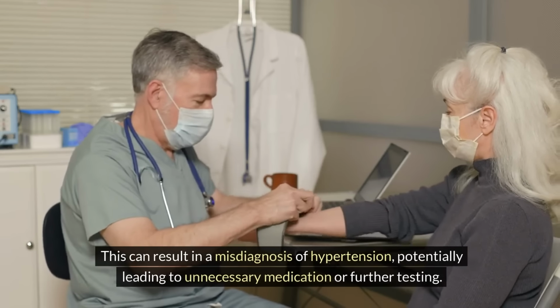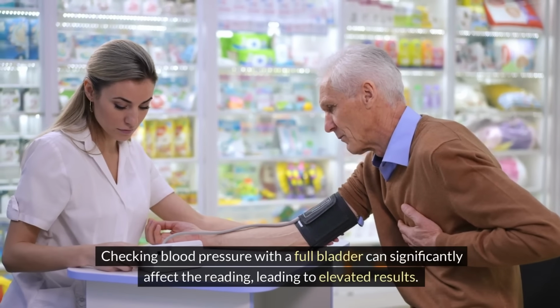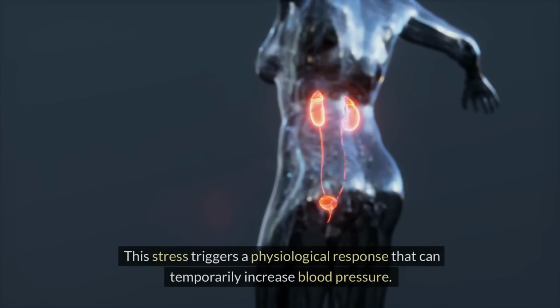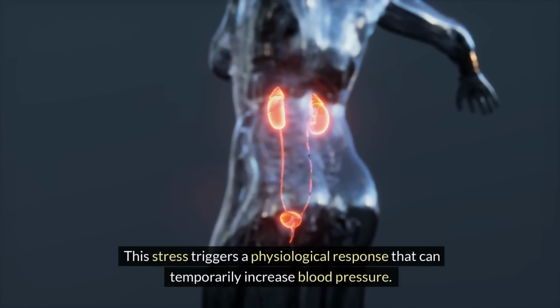8. Full bladder. Checking blood pressure with a full bladder can significantly affect the reading, leading to elevated results. When the bladder is full, it creates a sense of discomfort and physical stress in the body. This stress triggers a physiological response that can temporarily increase blood pressure.